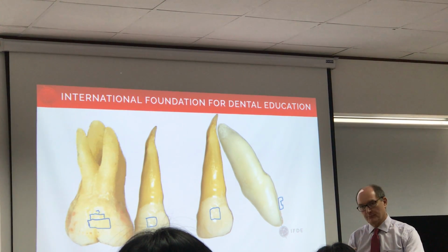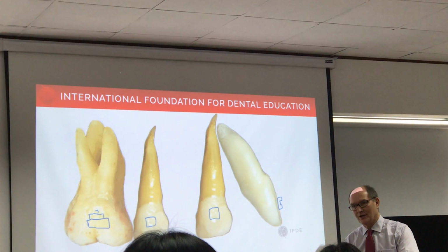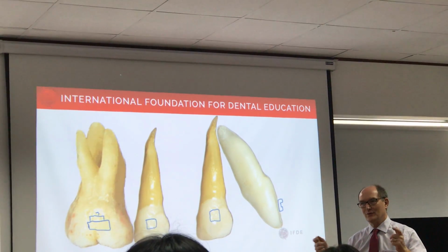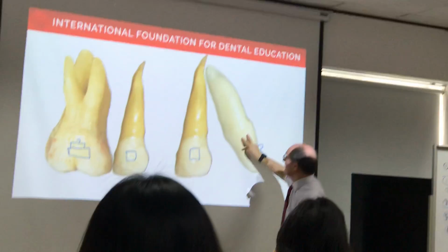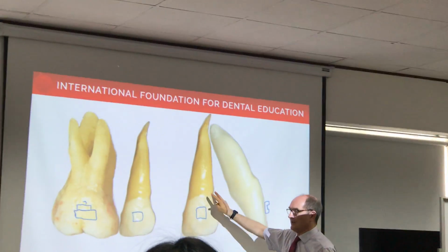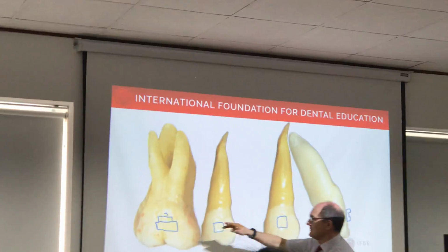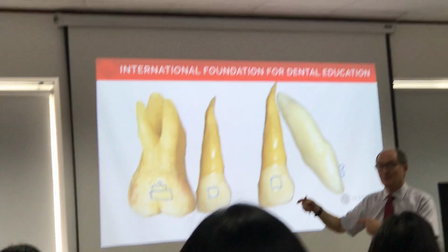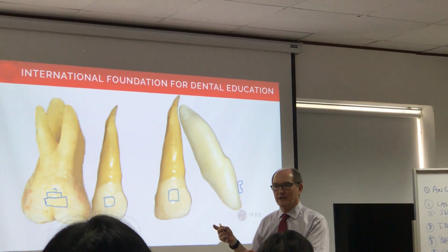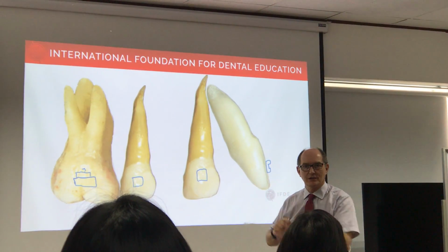But if I have double buccal tubes, I have a transpalatal arch, I have multiple different tools available to me to be able to not only be working on these teeth, but to also be able to work on this tooth as well. But I need to, as Dr. Rutrugi is saying, what are my moments, what are my counter moments, am I taxing anchorage incredibly, or are two different movements countering each other out?